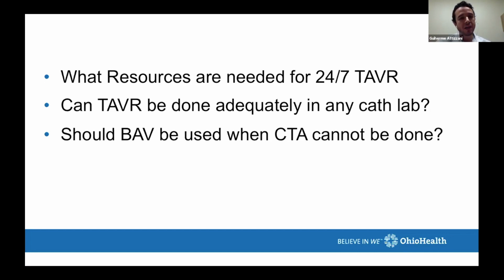There's the paper that just came out on JACC Intervention recently from the TVT registry, and we published our internal data of 700 patients years ago of urgent/emergent TAVR. And these patients for emergent, they just don't do well, right?